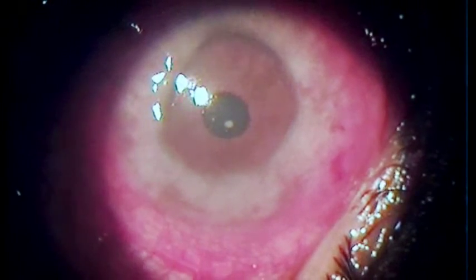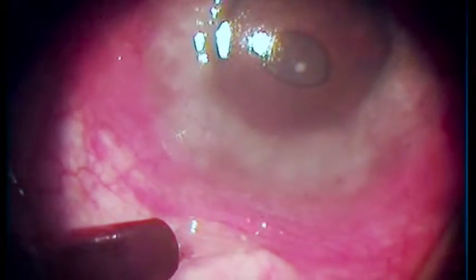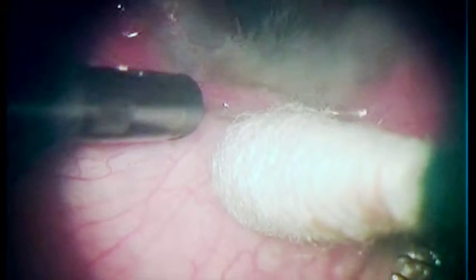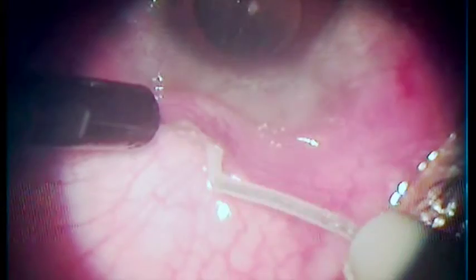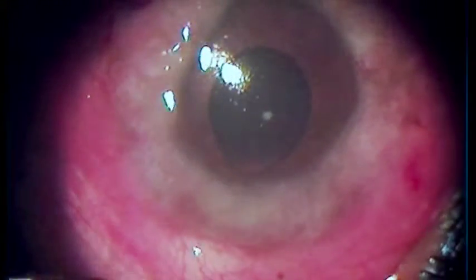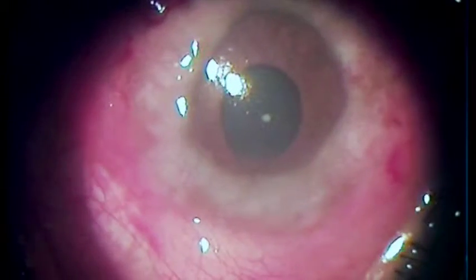Here we are going to use a blunt sapphire knife — you have to have a crystal knife; you cannot use a metal device because that will short circuit. This is a 200 micron Fugoblade tip and we have gone inside two times. It was used at highest energy, so we will get a track of 300 microns plus both times.